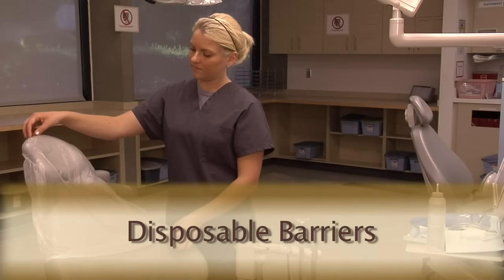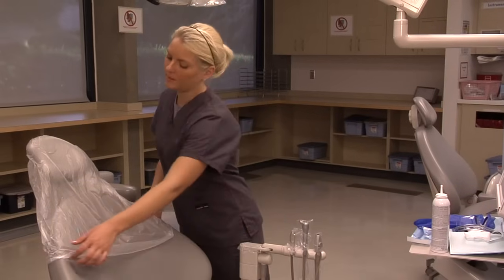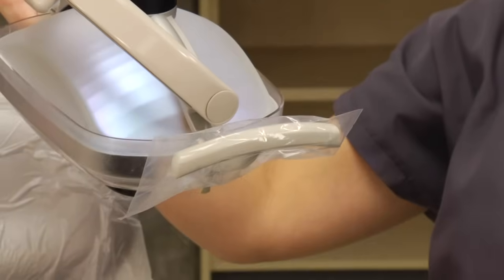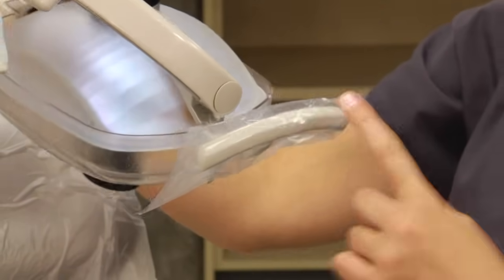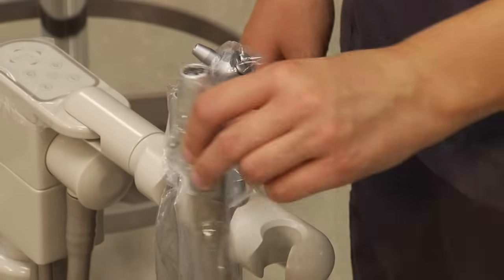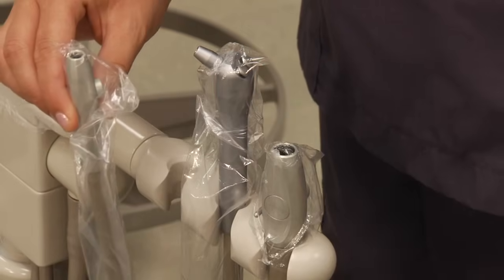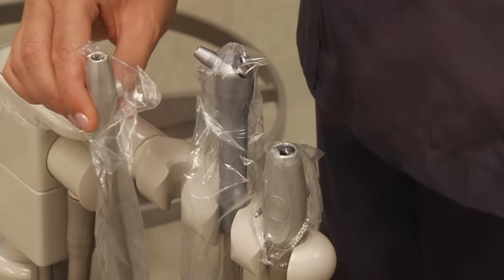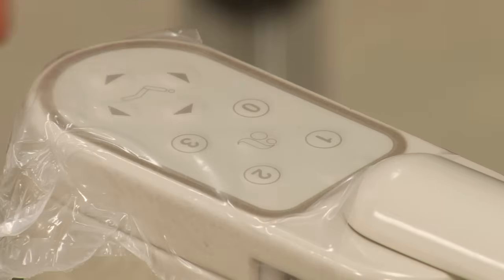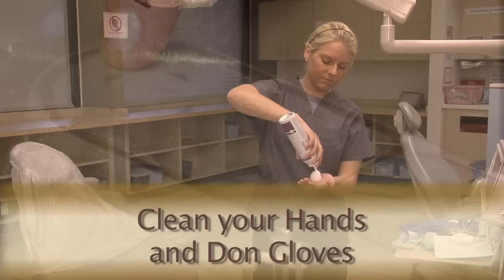With clean hands, no gloves required, place the disposable barriers. Those needed for this procedure are the patient chair, the light handle on the dental assistant side of the chair only, the light switch, the HVE, the LVE suction devices, the air water syringe, and the patient chair control touchpad on the dental assistant side only.